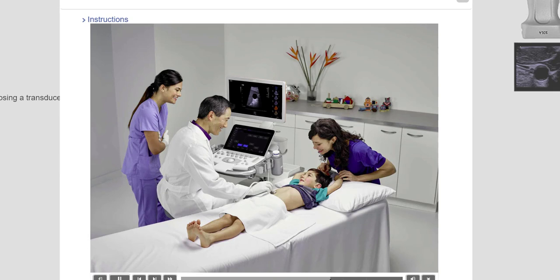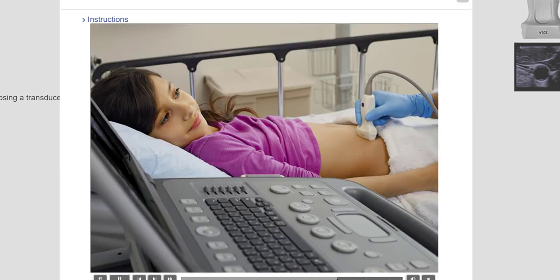Depending on the size of the child, select a curved transducer with an appropriate footprint and frequency range for the pediatric abdomen. In a child's abdomen, a higher frequency curved transducer will provide a superior image of smaller abdominal structures of a child. As an alternative, if a high-frequency curved transducer is not available, choose a high-frequency linear transducer and enable the trapezoid setting to extend the angle of the FOV.